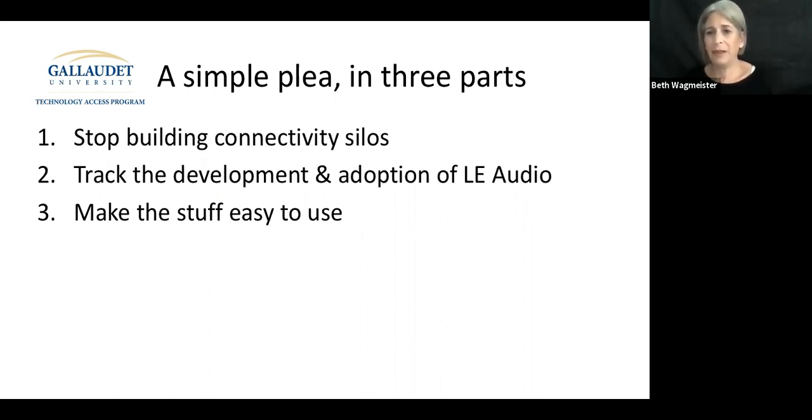And then the hearing world technology, make sure that LE audio, it's really important, it's really cool, supports both microphones and broadcasts. So that's really important for one-on-one conversations as well. Also included the point of connectivity with hearing aids and CIs. So I'm praying, that's my plea as we look for technology in the future and for CI users, I hope.